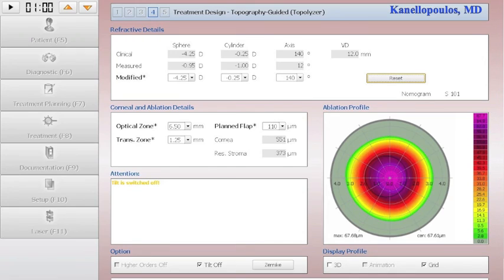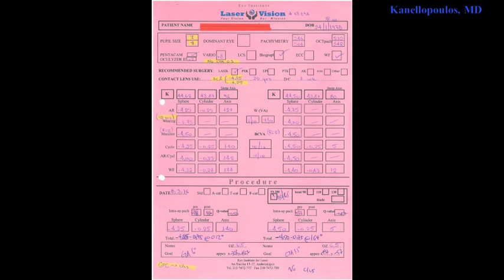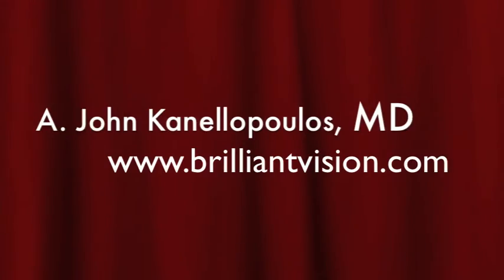So, in reviewing, you can see here the treatment, if we were going to use our clinical refraction confirmed by Wavefront, you see the topography-guided device will adjust for angle kappa, but its suggested treatment suggests more astigmatism. This is with zero refraction, you can see the normalization and adjustment of asphericity performed by the device. And, we decided that this is worth 0.25 of extra myopia to be corrected. And, although these are the numbers of clinical refraction before and after dilation, Wavefront, and auto refraction before and after dilation, this is our final treatment to be performed, which includes more astigmatism according to the topographic data, angle kappa, and thus, the adjustment of our correction.